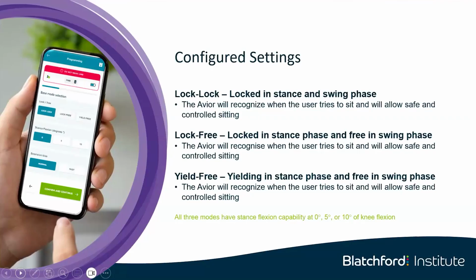With this, we can actually give supported assistance to getting them up there. So actually, you can use the leg to ratchet the way up to that lock position, or top the lock knee. We have lock free, traditional. It's weight activated. Once you put your weight on the knee, whether it's flexed slightly or extended, the knee will lock up and support the patient.